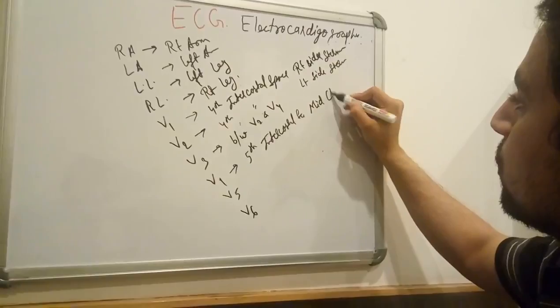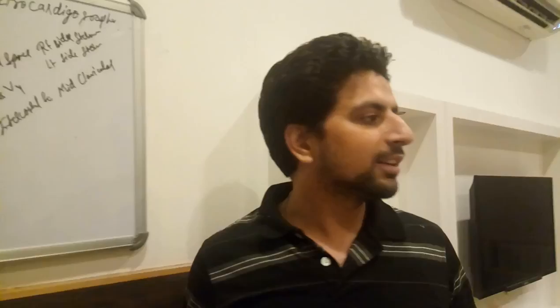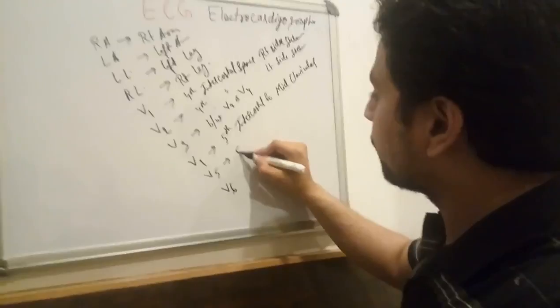Clavicular. I hope, my dear friends, if you have ever done ECG by your own, you can see and understand. It's very necessary. Sometimes I saw so many people, they don't know where they are putting, but they have a lot of experience and they are putting with the help of their experience, and that time this is also correct. I saw, but we have to know the mid clavicular region.